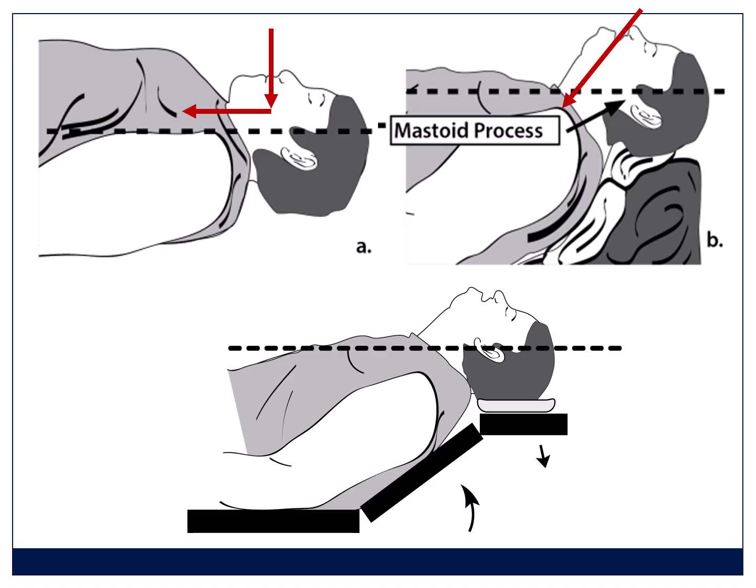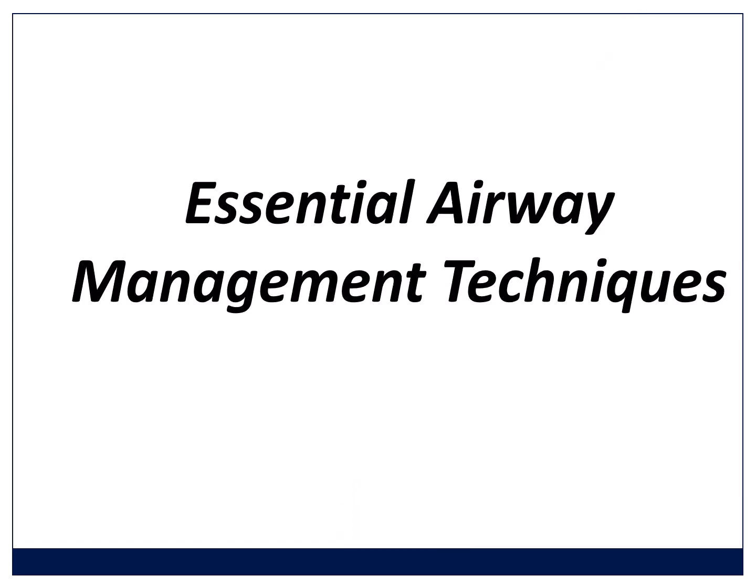So I position patients and then I walk around laterally on the bed and I see how that head has come forward. And notice also the thyromental distance now looks much longer. It's a good way of testing if you've got the positioning right. So get this positioning right. Spend time doing this before you attempt an airway.